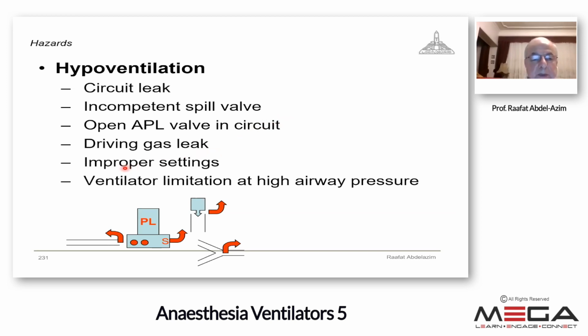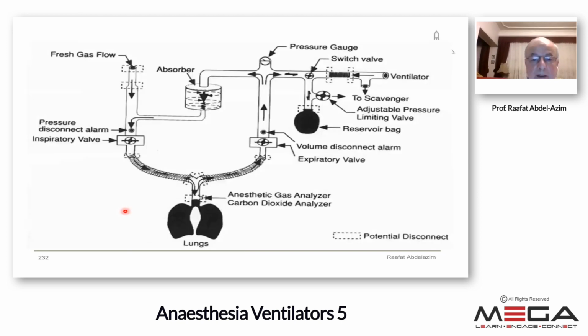Driving gas leak, improper settings, ventilator limitation at high pressure, airway pressure. There are possible leaks here, the possible disconnection areas, and the most common here is at the Y piece. The dashed areas are for possible disconnection.